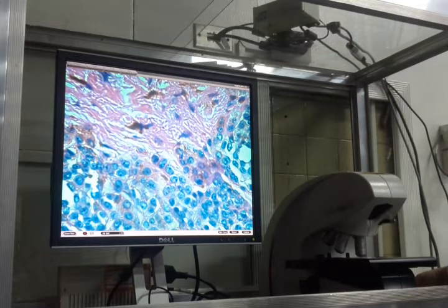This is an intradermal nevus. It is benign. If it becomes malignant, you call it a malignant melanoma. A melanoma is famous to you because it's one of the lesions which ends with an oma but is malignant. Okay?